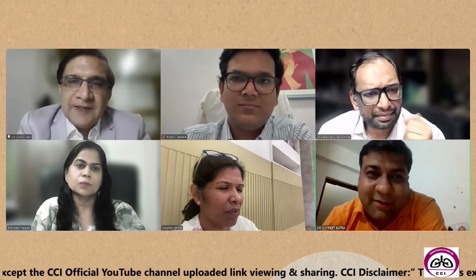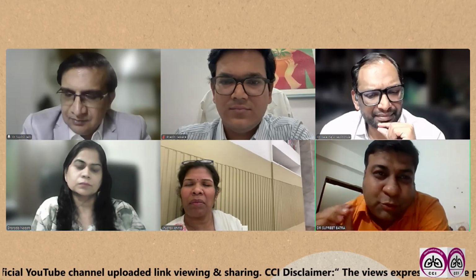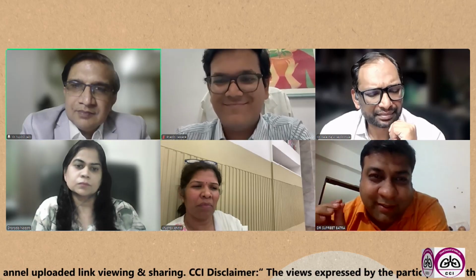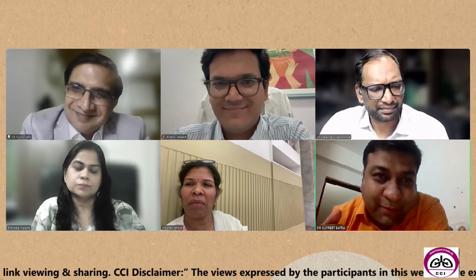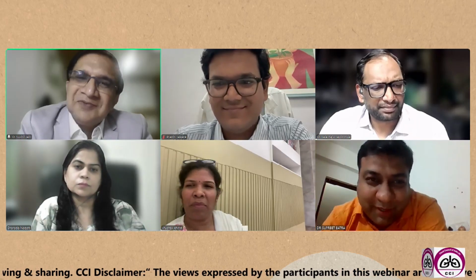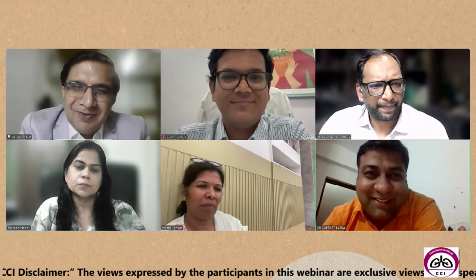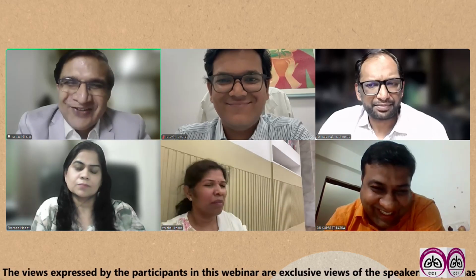Yes. And Dr. Bala, one more thing: we were talking about cough. In a conventional TBNA, we used to ask the patient to cough, because there are three techniques, including the jab technique. So cough was one of the techniques for getting a sample in a blind TBNA, I'm telling. But now we know EBUS, so we are very much scared. We just withdraw it.